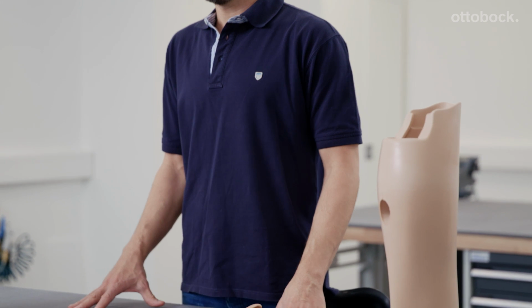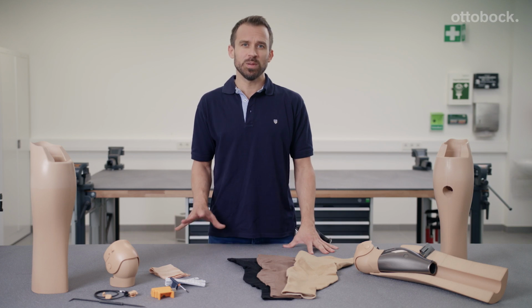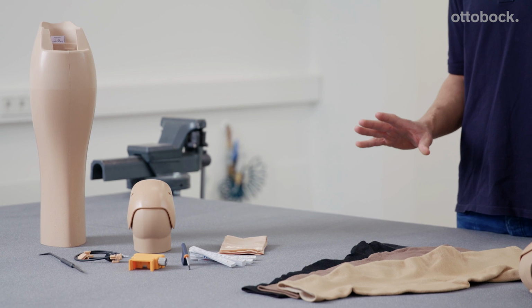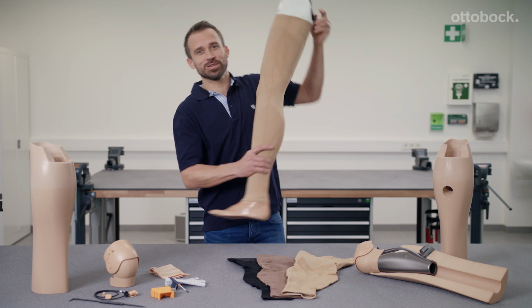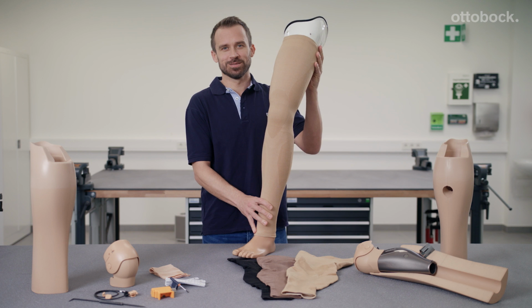My goal is to help prosthesis wearers look their best in addition to achieving the highest possible level of mobility. They should be able to accept their prosthesis as a fully adequate replacement for their leg. So today, I'm going to show you a leg prosthesis with the functional Cosmesis, which I think is an impressive solution that looks good and is functional as well.